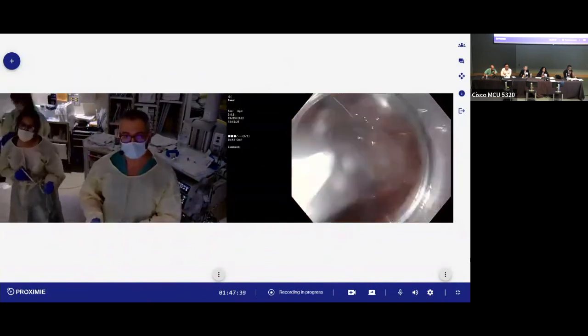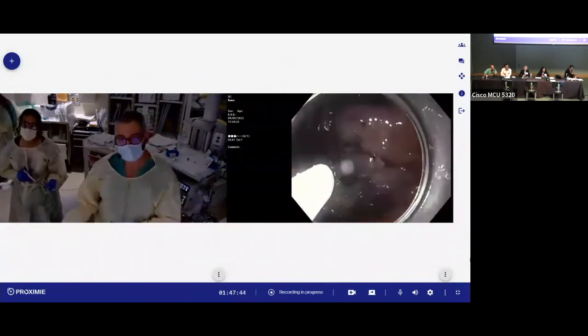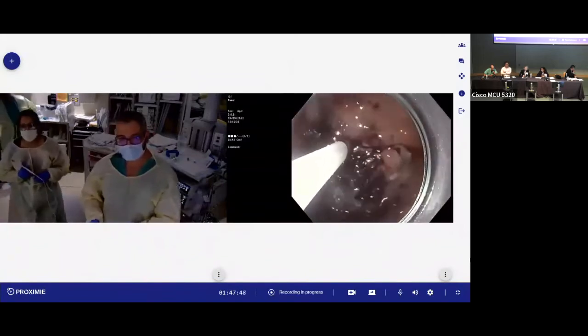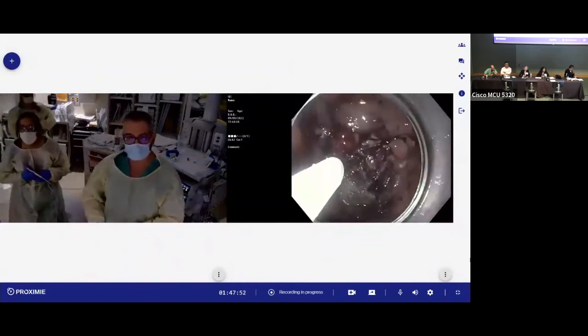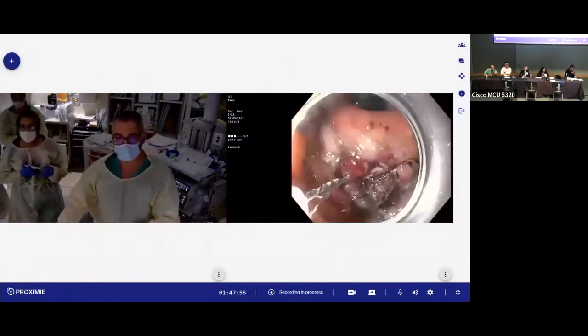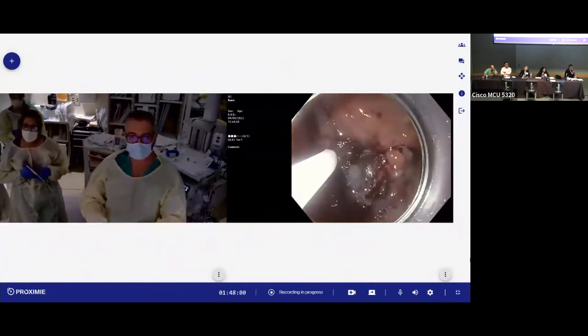Open. Yeah, that's a little bit. Okay, yeah, a little bit more. Let's open more. Yeah, I would open. Yeah, let's open to remove this part. So open more. Yes, good. So I'm not able to get into that position easily. So I'll try. I can utilize whatever I dissected, open more, but it's such a small area.